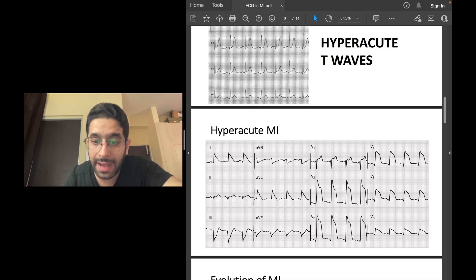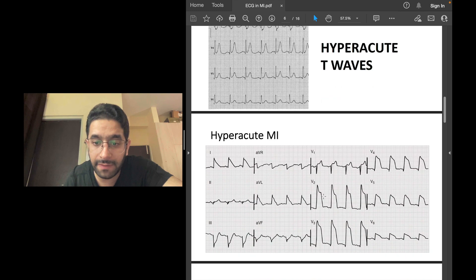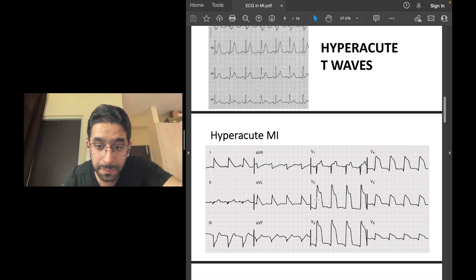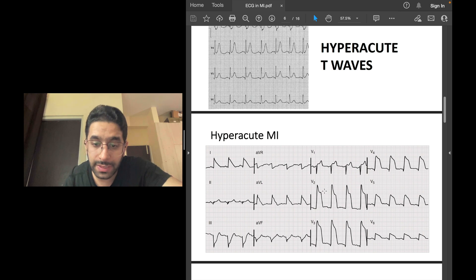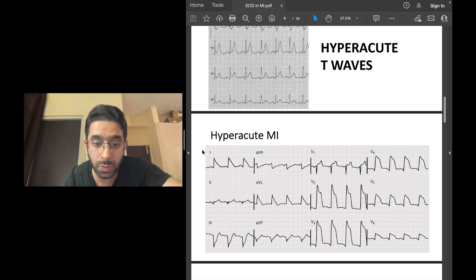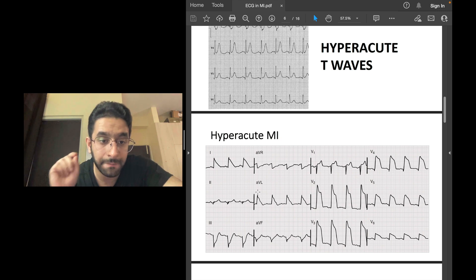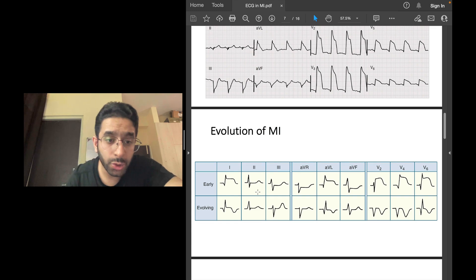In this next ECG showing a hyperacute MI, the tall peaked T waves have merged with the elevated ST segment, so the picture represents an elevated ST segment and a tall peaked T wave joined together. These are ST elevations and hyperacute T waves in V2, V3, V4, V5, V6, lead 1, and AVL — representing an extensive anterolateral ST elevation MI.